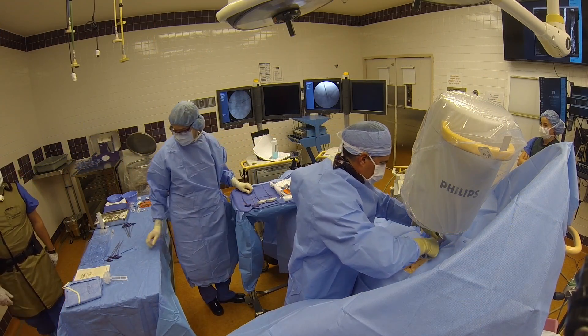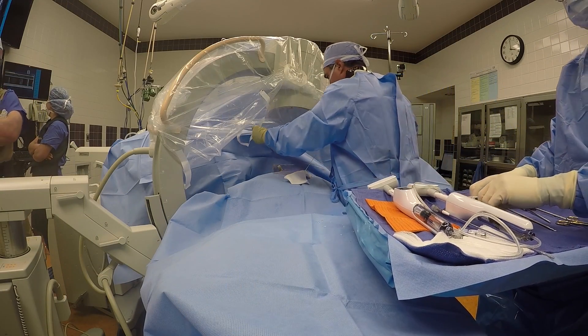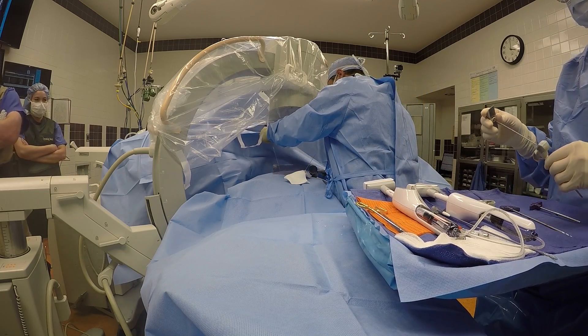This is important because I must place a very large needle blindly through the skin, through a very small passageway in the vertebral body, and ultimately end up in the bone.